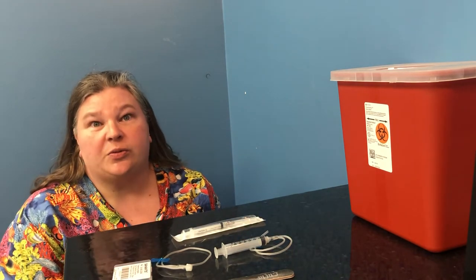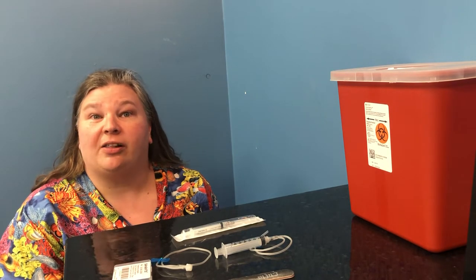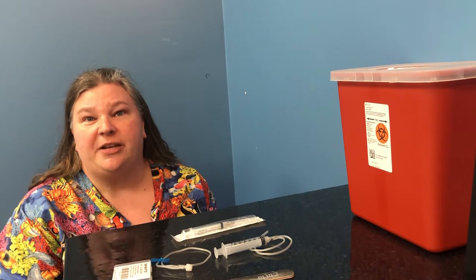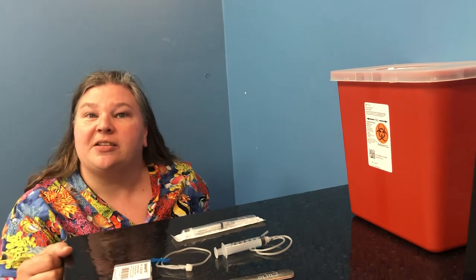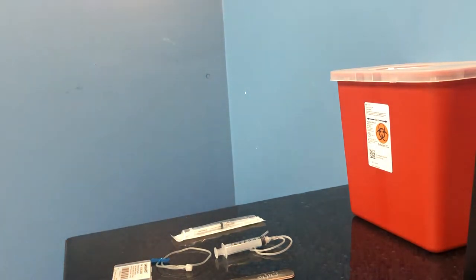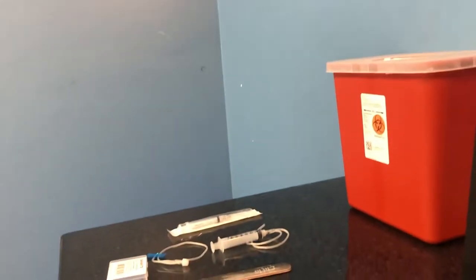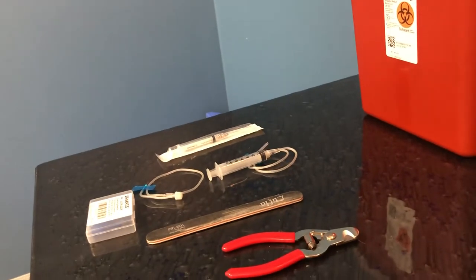We're gonna use these when we're teaching things like vaccinations, IM injections, or blood collection specifically. So let me just give you a little close-up look here so you can see what this equipment is all about and what it can do. I'm gonna move your camera down so you guys get a nice little close-up here of what this stuff is all about.